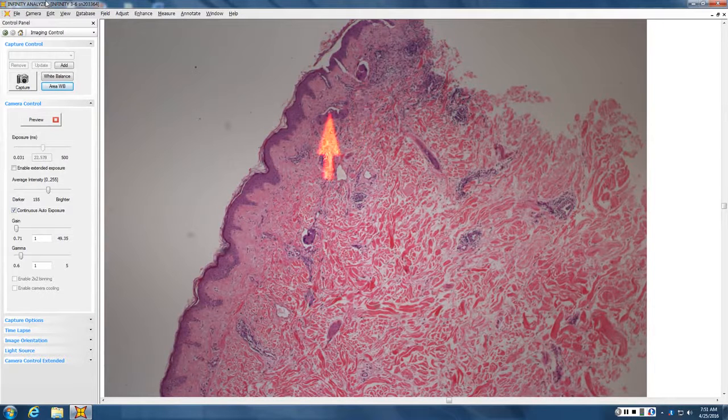Okay. So thyroid. The intralymphatic tends to be what kind of pattern of? Tone that pointer down just a bit there. Seems like the answer is no. So anyone want to jump in? Inflammatory. So that's inflammatory carcinoma.